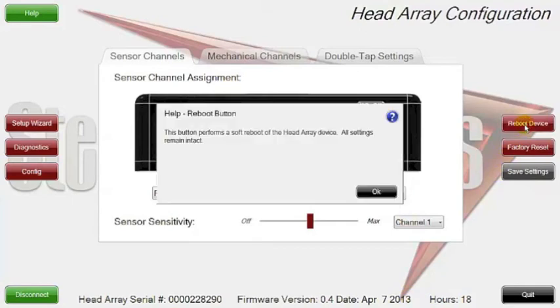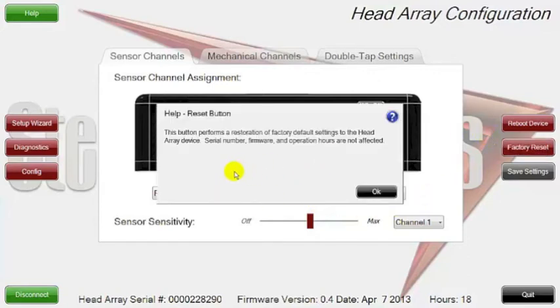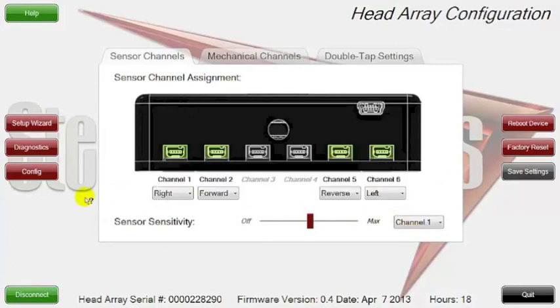We also have a reboot device button which performs a soft reboot on the head array device. Sometimes if something is acting a little glitchy, you can do a soft reboot without having to turn the chair on and off. We also have a factory reset that does a standard reset and gets all your ports back to the way they came from the factory. And any time you make a change in any of these tabs, this button turns red letting you know that you've made a change that you need to save.